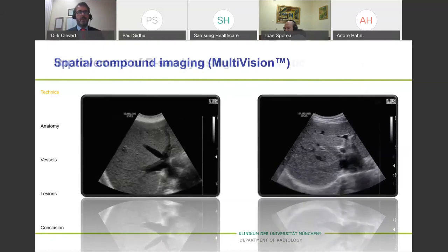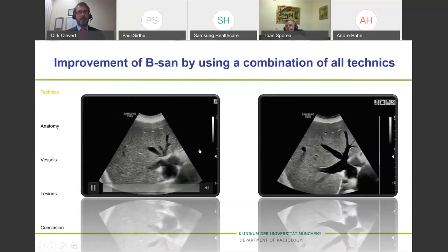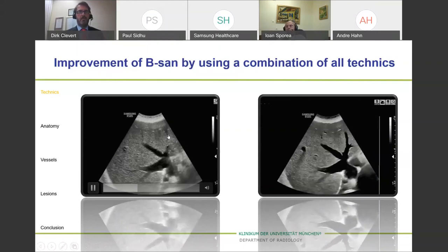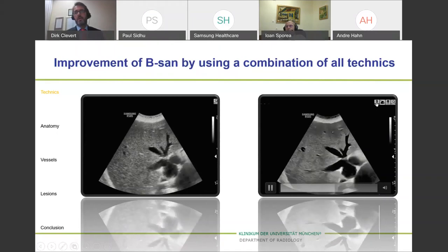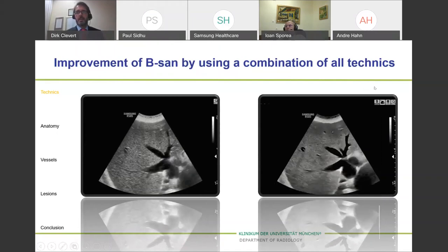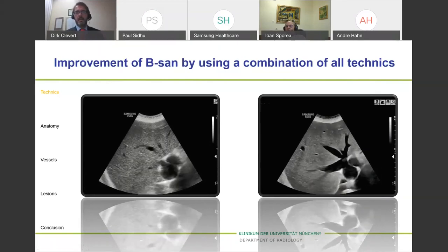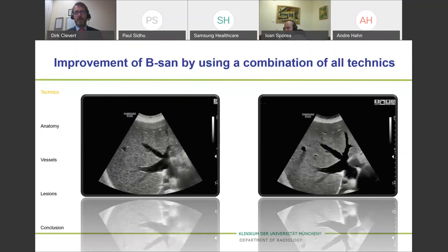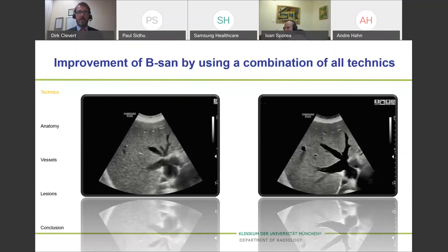There is also the option to use all techniques in combination. This is a pure grayscale image without any algorithm, and this is the same information with everything switched on — Speckle Reduction Imaging is on, Harmonic is on — and you see immediately there is an improvement in the quality of the grayscale image, including an improvement of the vascular appearance and the pattern of the liver.